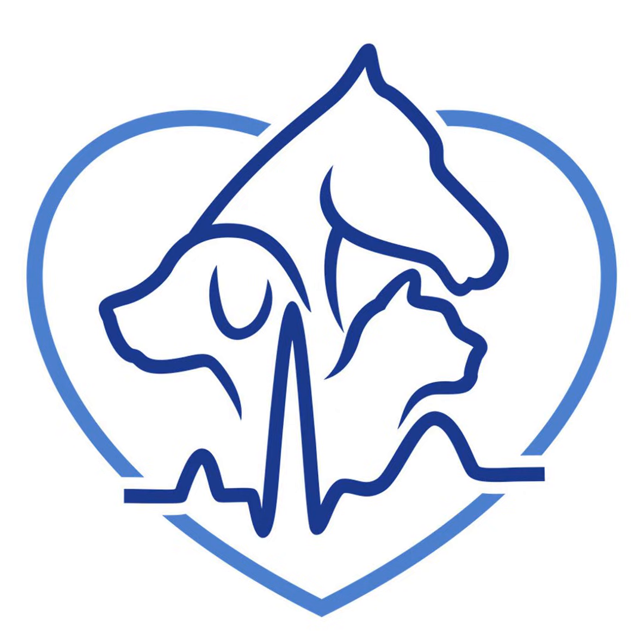Trying to get 3 views from the left apical perspective, I think 2 is understandable. An apical 4 and then that inflow-outflow view are pretty attainable and routinely acquired in cats. An apical 2-chamber is a very challenging view to get in cats, and it adds additional time.